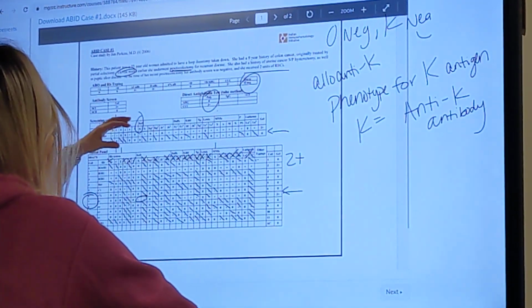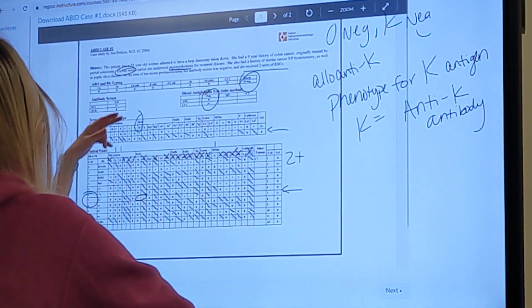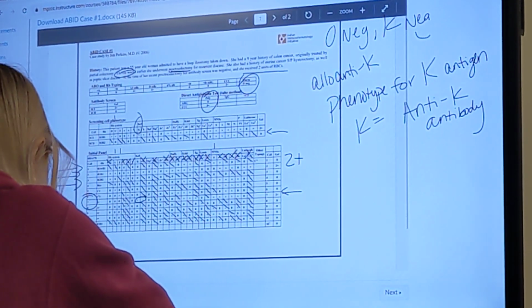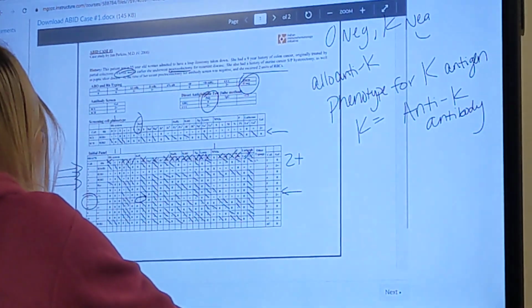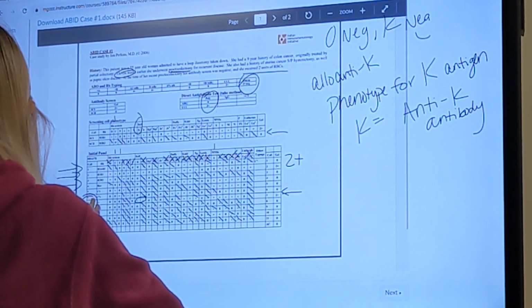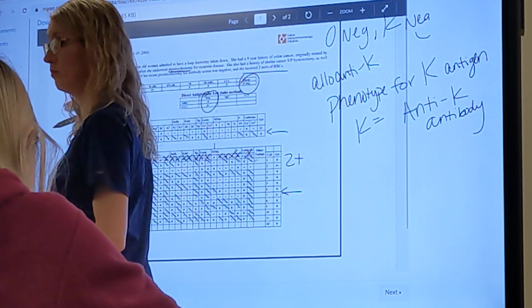Yeah, so if you look here, this is your clue to the frequency. If everybody has the plus sign, each one of these is a person, right? So this is Peyton, this is Kim, this is Brett. So just remember that each one of these is one person. They're not pooled. So out of these, we really have 12, 13 to pick from. Random people.